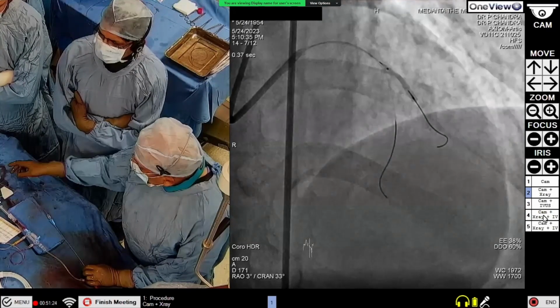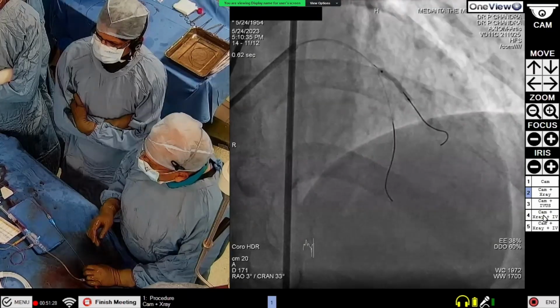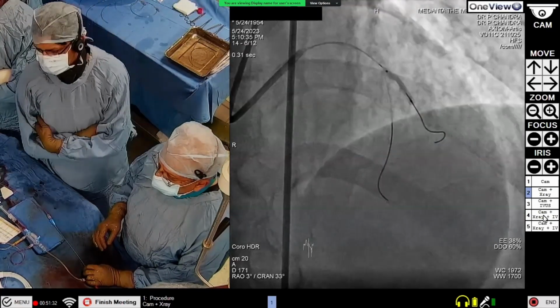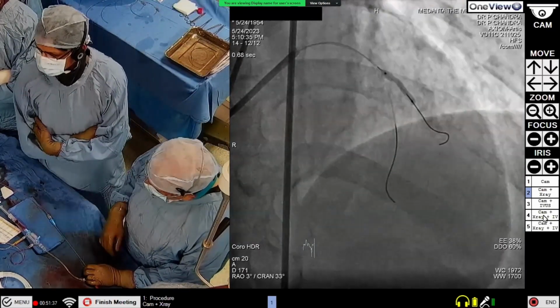It remains natural. If you put too many stents, then nothing can be done. Recurrent restenosis is very difficult to deal with. Patients are coming every 6 months for a restenosis, and you are dilating them, and they're coming again. You can't do anything for them.